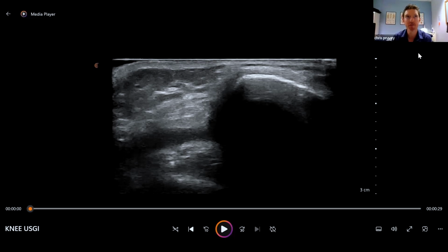They're not good enough to diagnose very, very minute things when I need to write a formal radiology report. So I might get asked a question, just scan a shoulder. I'm not really assessing a shoulder if I'm working in radiology. I'm just writing a report structure. So I wouldn't use it for that.